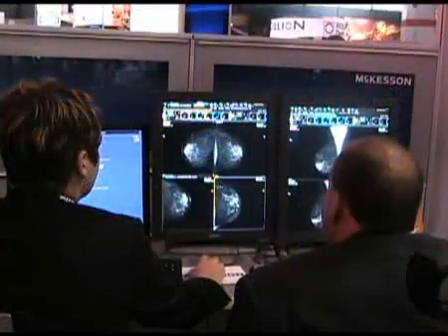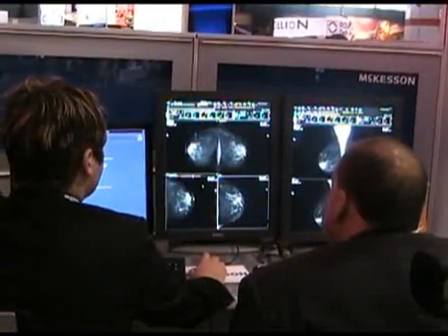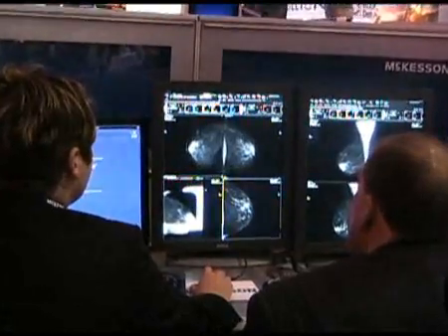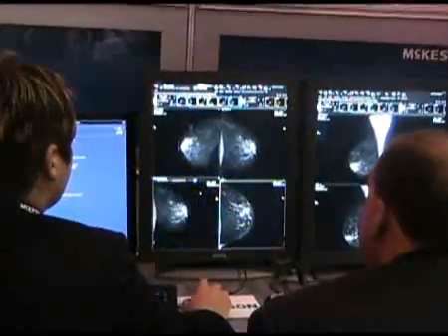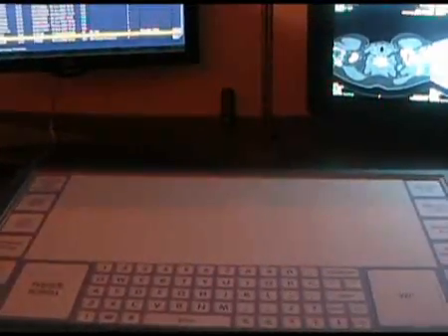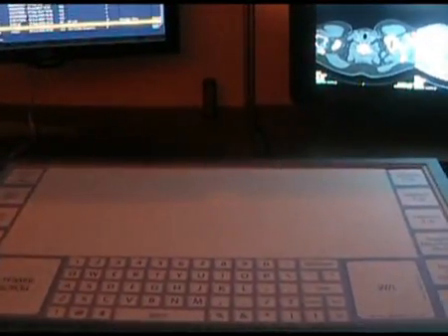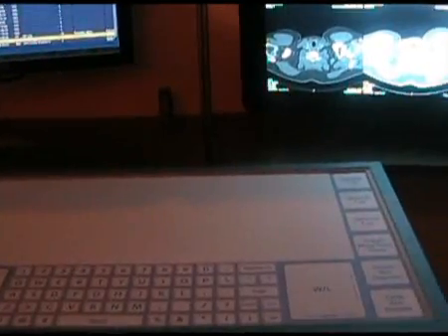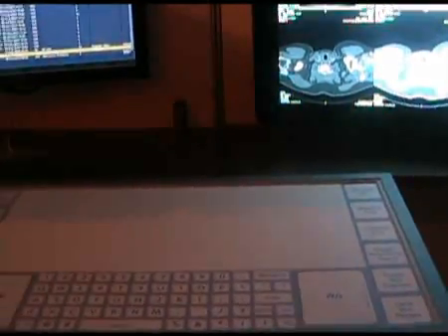Hello, welcome to the McKesson booth. Some of the many innovations we are showing today are an advanced mammography package and a touchpad that allows you to control through a panel the size of a small table the workstation in front of you, completely replacing a mouse and a keyboard with a much more efficient and intuitive user interface for the radiologist.